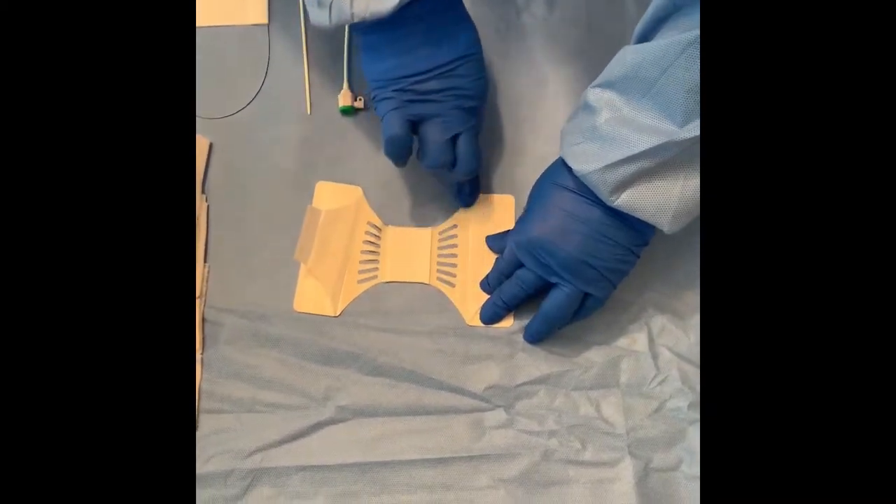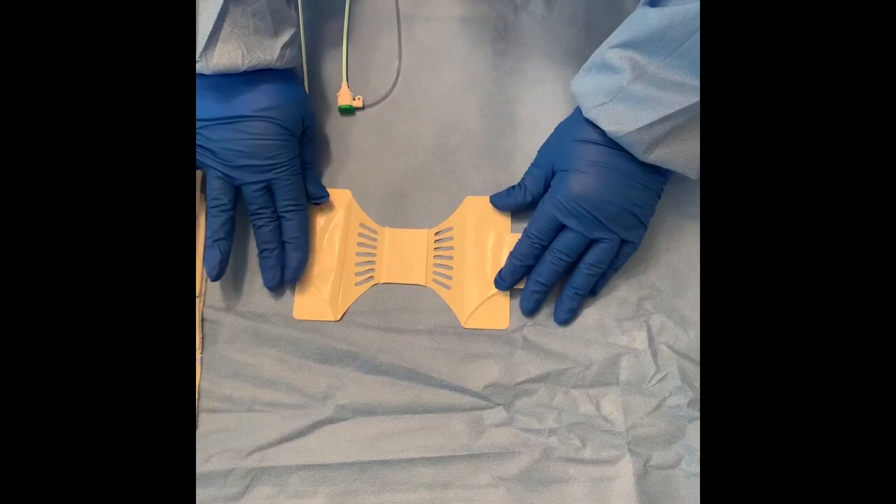For band placement, you can proceed per the IFU, or follow these steps which places the bandage first, then the roll dressing.